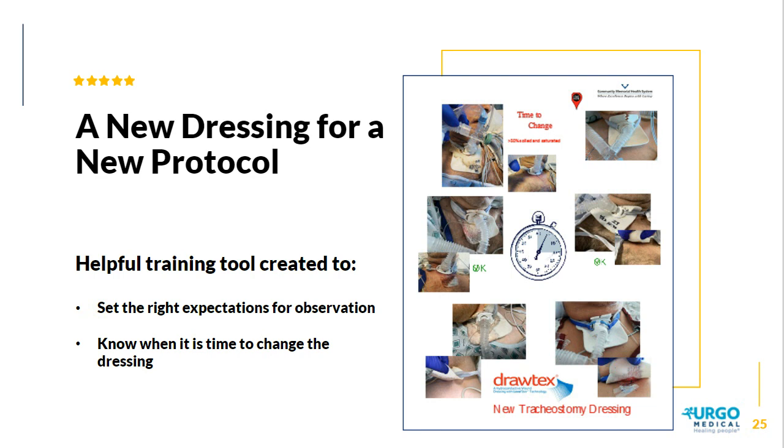And what we found with this whole protocol development was that we couldn't actually set a time of frequency change. We had to teach clinicians how to assess the dressing itself and base their dressing changes on what it is that they observed. It took a little education on our part to tell the patient, families, respiratory therapists, and nurses that while the dressing would look ugly, you pick the dressing up, look underneath, and that skin looked completely intact.